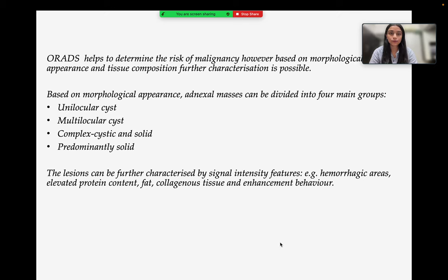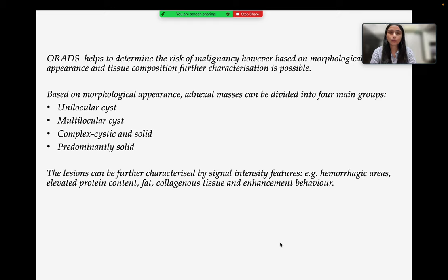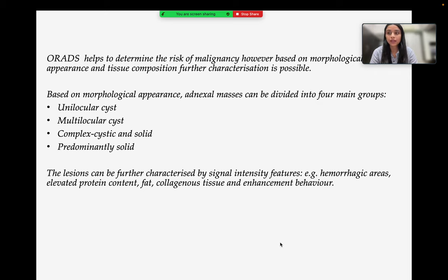Based on morphological appearance, adnexal masses can be divided into four main groups: unilocular cyst, multilocular cyst, complex (containing both solid and cystic components), and predominantly solid. The lesions can be further characterized by signal intensity features such as hemorrhagic areas, elevated protein content, fat, collagenous tissue, and enhancement pattern.